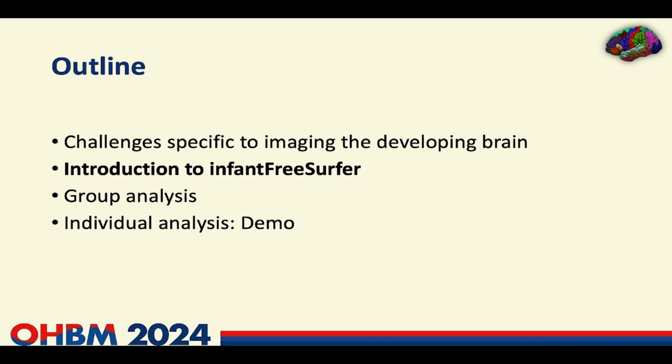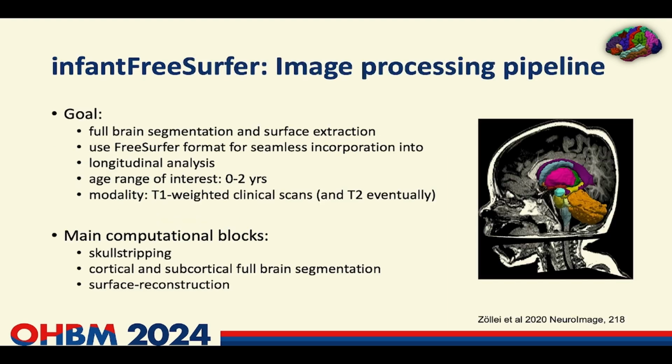So an intro to FreeSurfer. You have heard about FreeSurfer before in the previous slides. So the goal when developing Infant FreeSurfer was to develop an image processing pipeline that would be particularly useful for these initial first 2 years. The modality of interest at the time of development was using T1 weighted MR images.